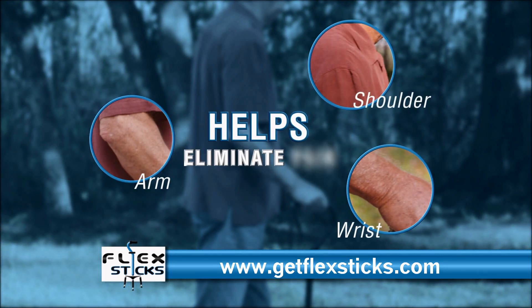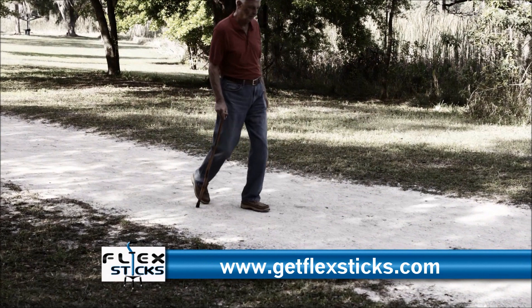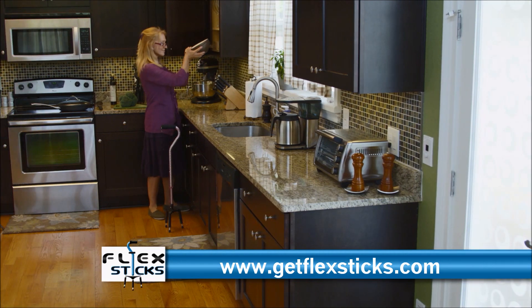FlexStick helps to eliminate the pain associated with old-style canes. Single-point and rigid four-point canes don't adjust to you or the terrain, and they can be unreliable on most surfaces. They even fall over, but FlexStick is designed with you in mind.